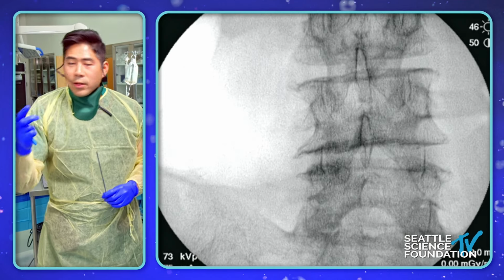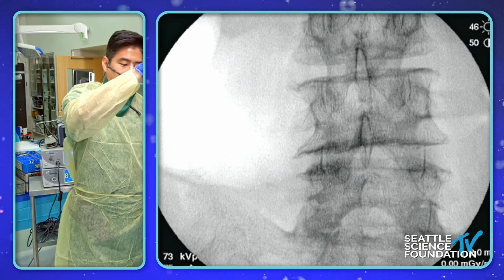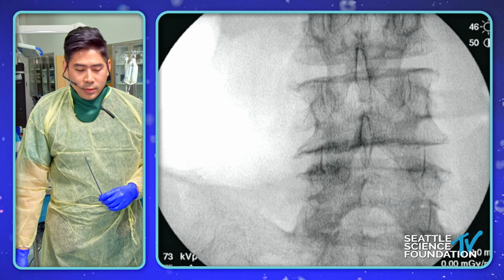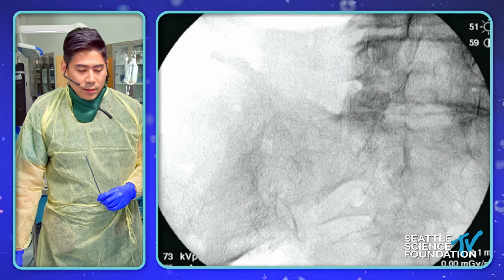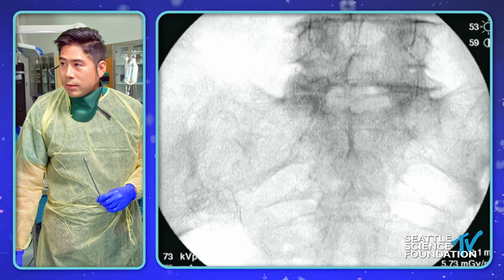Okay, so that's a 4-5. Do a little bit more angle of the tilt this way. So it's a 4-5, usually lordotic. Okay, that's good. Okay, take a shot there. Everybody's running into the table there. And maybe pull towards you.